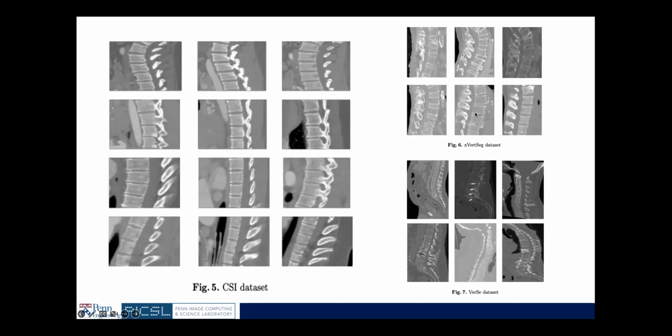So as you can see on the right, these vertebrae not only come from a different CT scanner or a different center, but there's a lot of fractured vertebrae like this one, and a lot of intervertebral discs which are dislocated. So can I train a network which is only trained on healthy population and then use the network to get segmentations on a data set which is unhealthy? So that is generalization, no knowledge about this at test time, right?